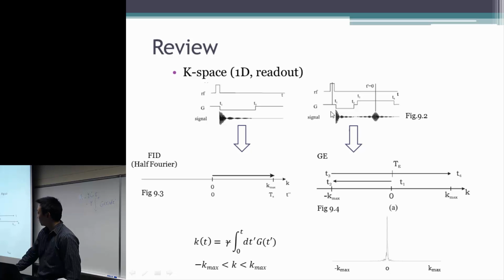So first we use a pre-phase gradient for the readout, so that we first push the K-space to one side, the negative side or the positive side, and then we use a long readout so that at the center of the readout, the gradient moments cancel each other out and form an echo. So at the center of the echo we have a zeroed zeroth moment of the gradients.